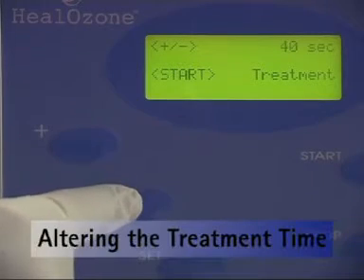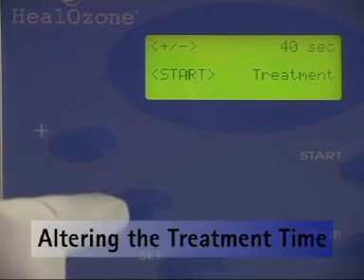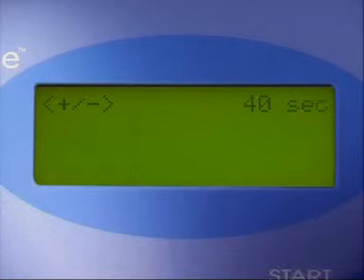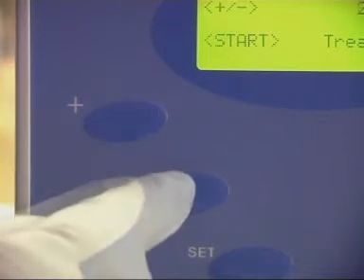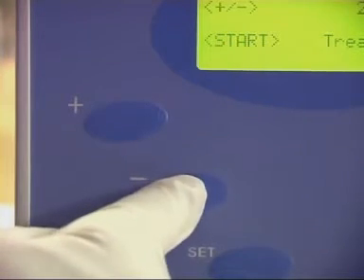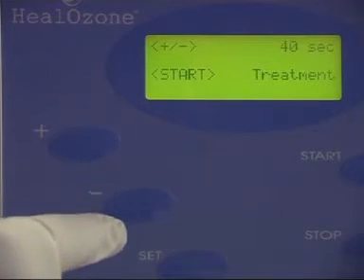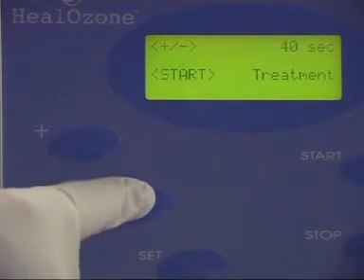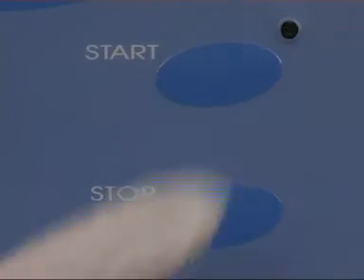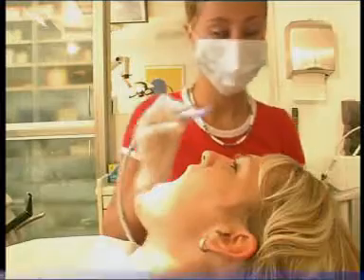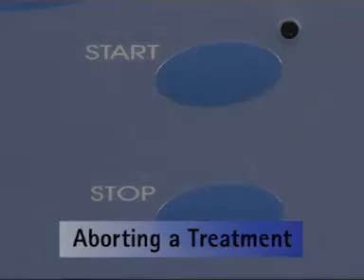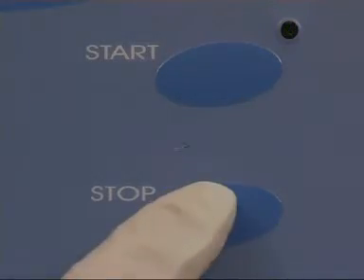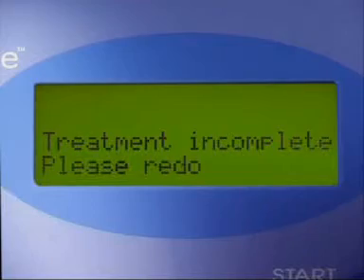What if you want to change the duration of treatment? Provided that you have not yet started applying ozone, you can use the plus and minus buttons to alter the duration time of the treatment, then press the start button. What if you want to abort the treatment? Simply press the stop button or the foot switch.